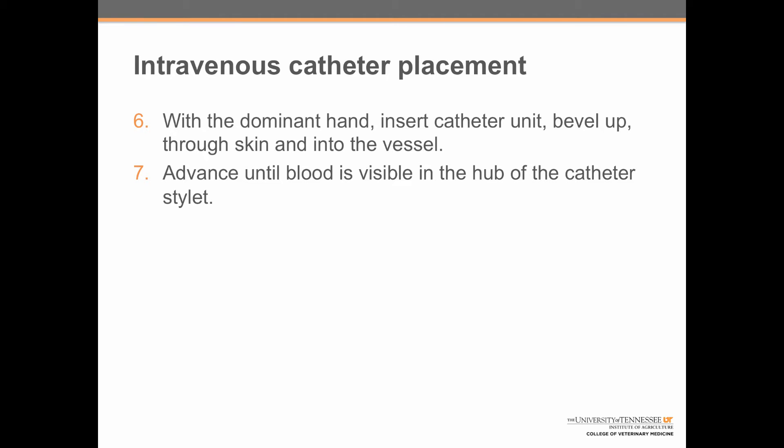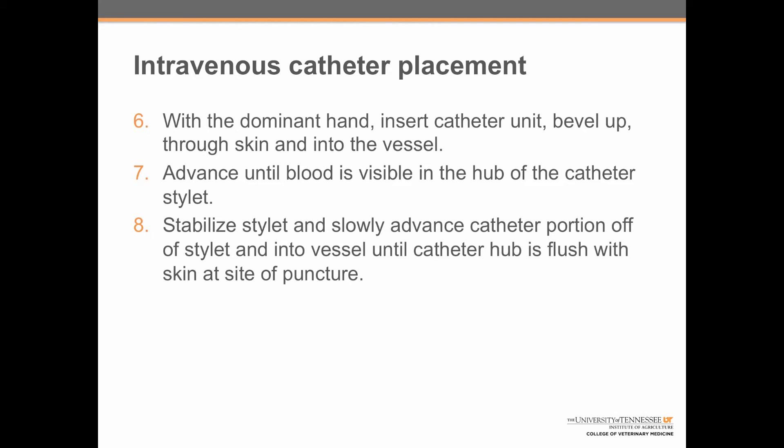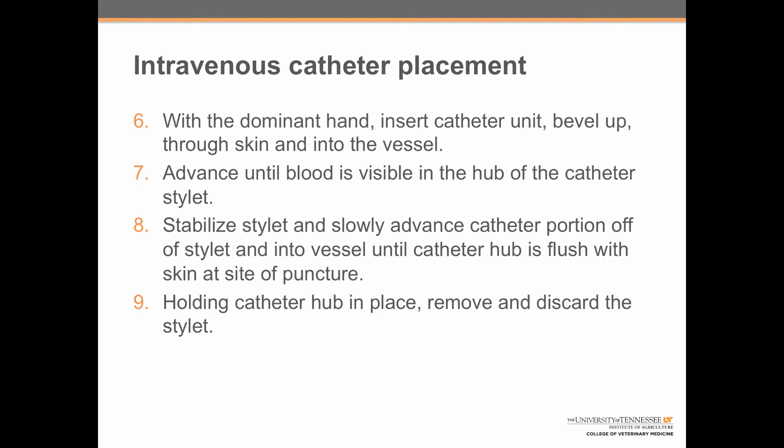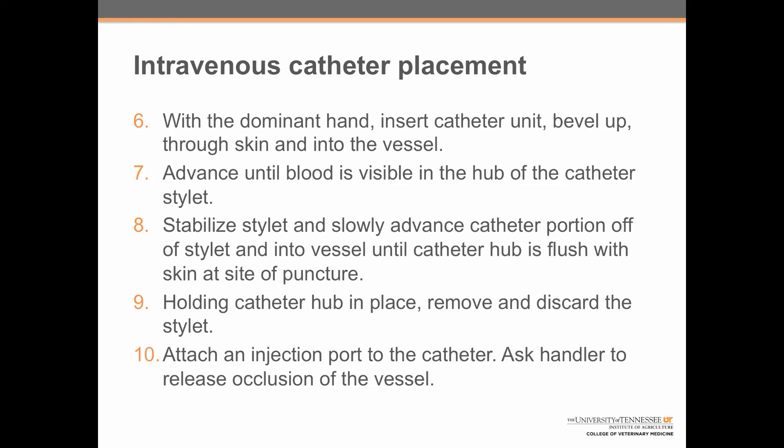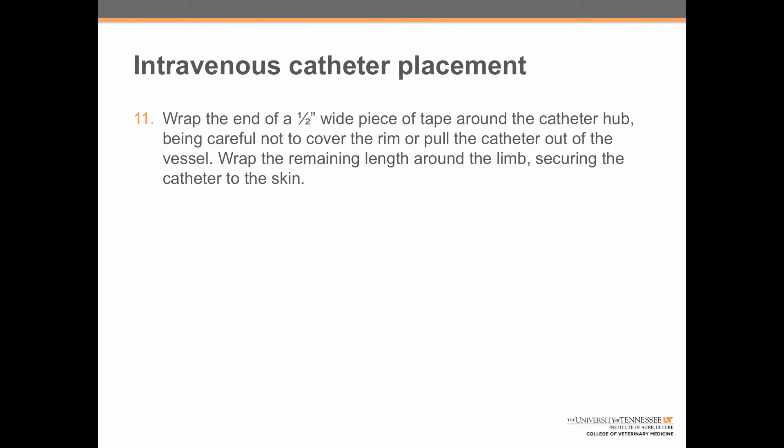Step 7: advance until blood is visible in the hub of the catheter stylet. Step 8: stabilize the stylet and slowly advance the catheter portion off of it and into the vessel until the catheter hub is flush with the skin at the site of puncture. Step 9: holding the catheter hub in place, remove and discard the stylet. Step 10: attach an injection port to the catheter and ask the handler to release occlusion of the vessel.